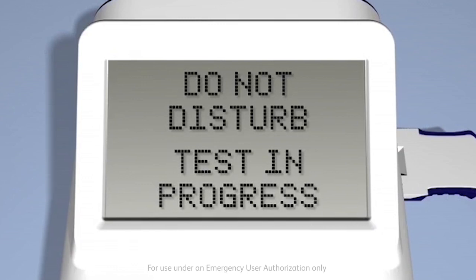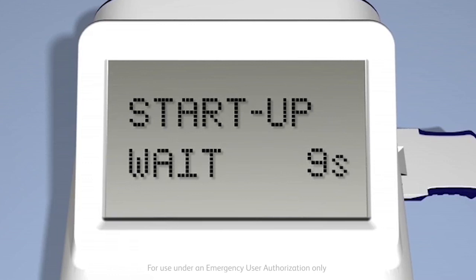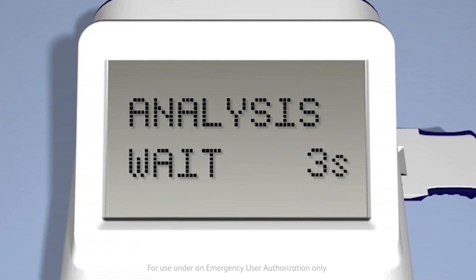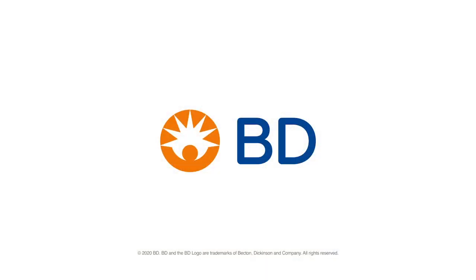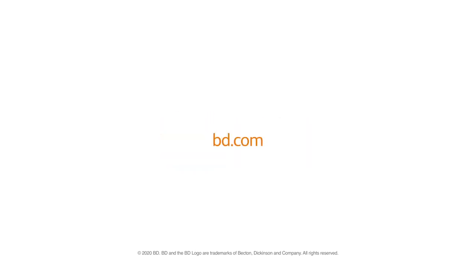A countdown timer will display the analysis time remaining. Once incubation is complete, the analyzer will progress through a reading step and an analyzing step. After the analysis is complete, the test results will be displayed. Do not touch or remove the test device until the result has been displayed and documented.